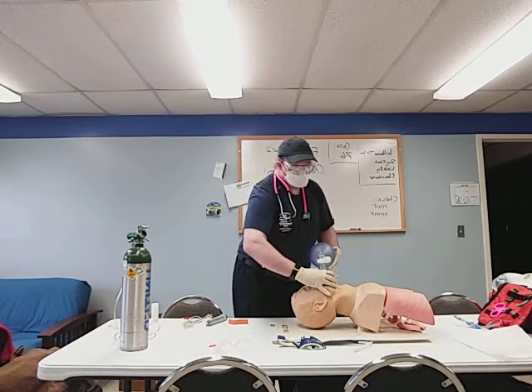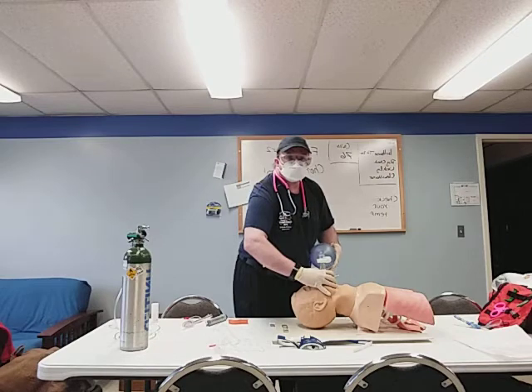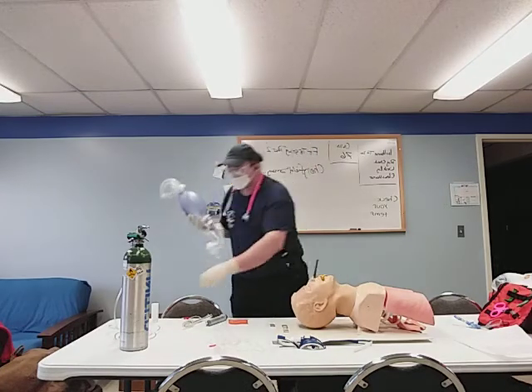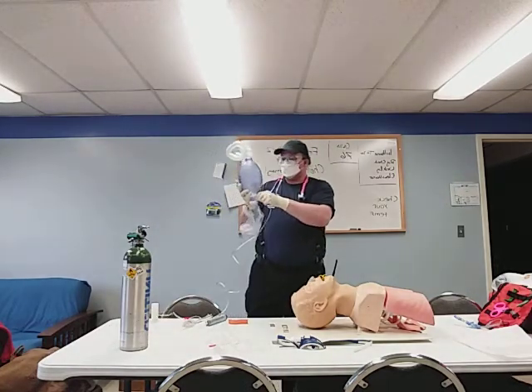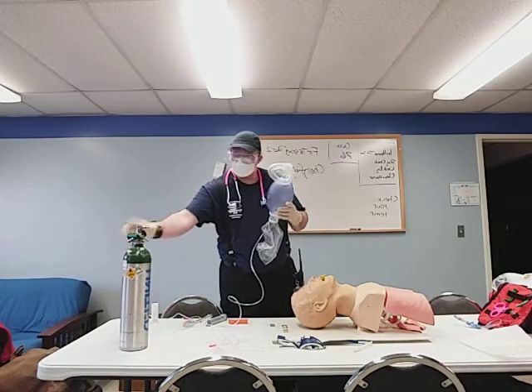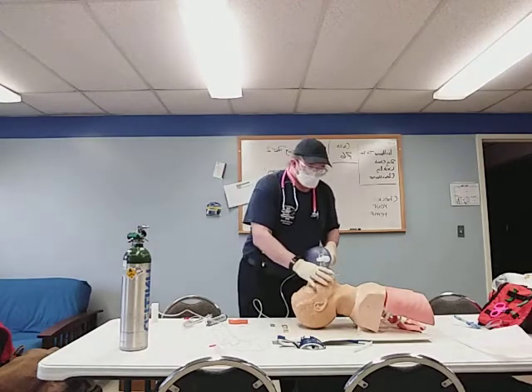When I put in the OPA, the evaluator told me that there was no gag reflex and the adjunct was accepted. But now I'm told the patient's oxygen saturation is 85% on room air, and that is not acceptable, so I'm going to apply some oxygen. They say 12 to 15 liters per minute is high flow oxygen. I'm doing 15, and it's high concentration.